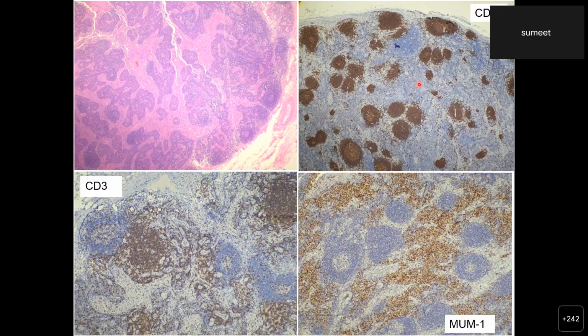Okay. So what you see over here is CD20. All of that which has picked up the brown stain is CD20. You find a very dense stain in the mantle, and a little less dense stain in the germinal centers. But notice that there is something here that looks like a little nodule or maybe a follicle, and it's not stained at all.